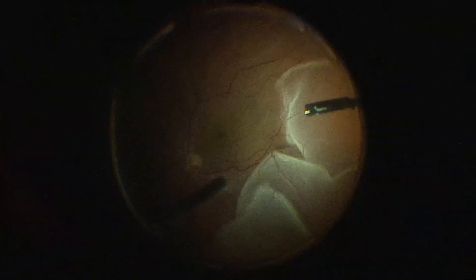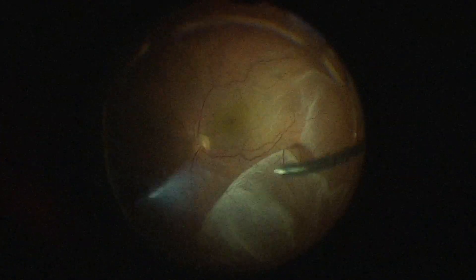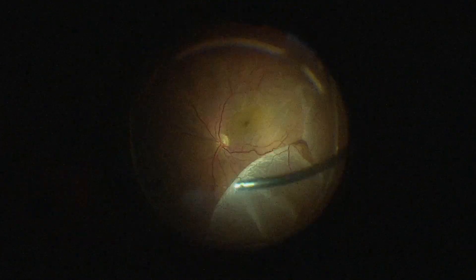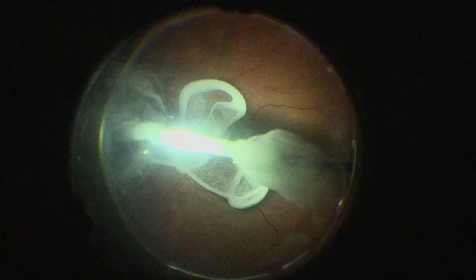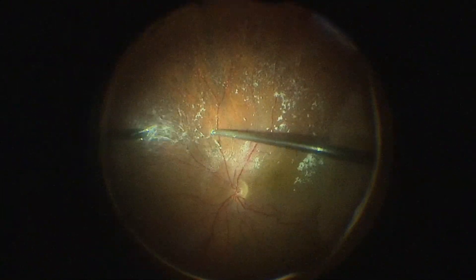The surgery begins with anterior vitrectomy, followed by core vitrectomy. The surgeon uses triamcinolone to stain the posterior vitreous, facilitating the induction of posterior vitreous detachment.